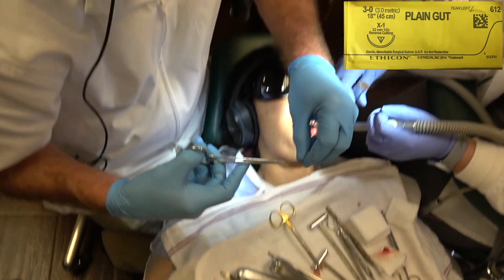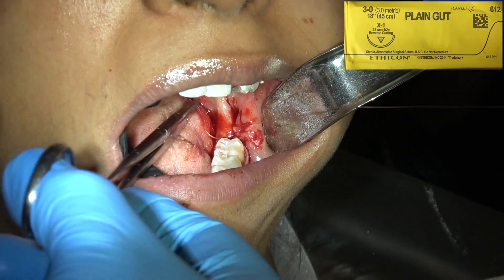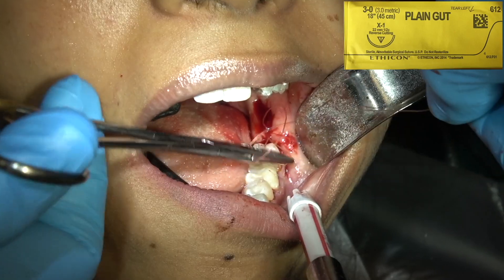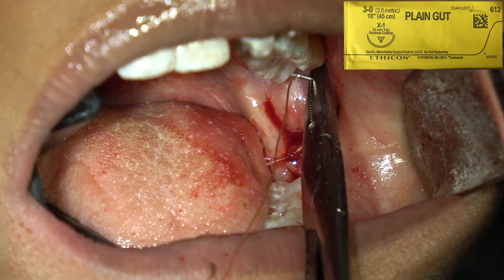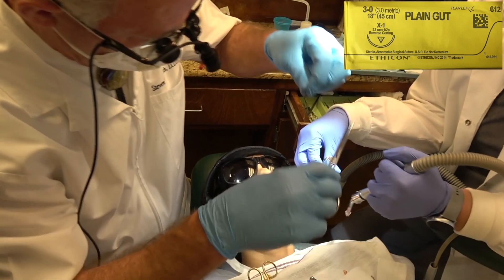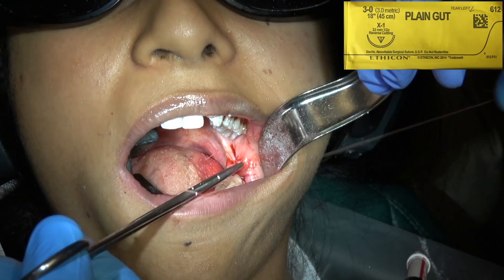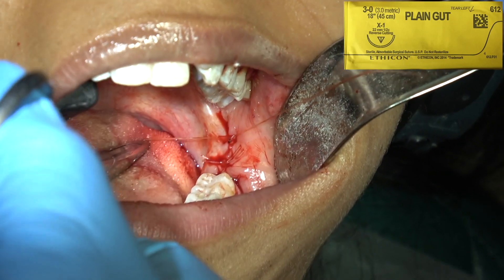Count your wraps carefully: 1, 2, 3 — pull. That will stay nice and tight when you do your second throw. Take a deep bite with your needle, wrap 1, 2, 3 — pull, then 1 toward you — pull, then one more away from you — pull. That's a good tight knot. Leave about a couple of millimeters of suture sticking up after you cut. Normally I place 2 sutures, but in this case I'm placing 3 because I went pretty far up the ramus. I rarely place more than one suture when removing a maxillary wisdom tooth.